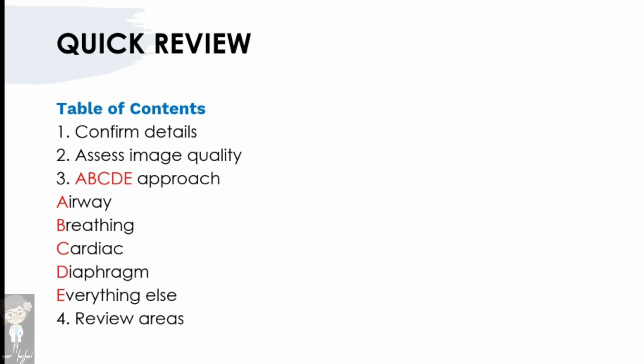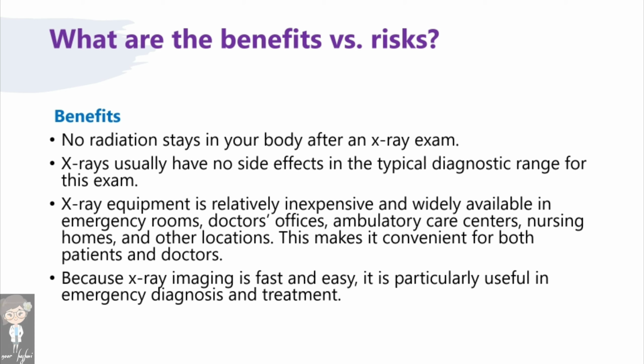Now you can revise the whole table of contents for quick memory, and lastly we will discuss some benefits and risks of X-ray radiation. A benefit of X-ray is that no radiation stays in your body after the X-ray exam, and it does not have any side effects if supervised by an expert. X-ray equipment is usually inexpensive and easily available in doctors' offices, emergency rooms, and ambulatory care centers, making it convenient for doctors and patients. Because of its fast and easy approach, it is preferred for first-hand emergency diagnosis and treatment.